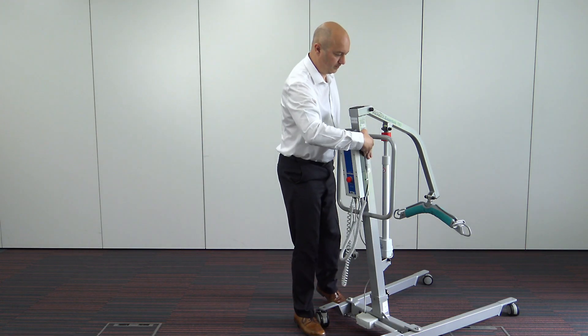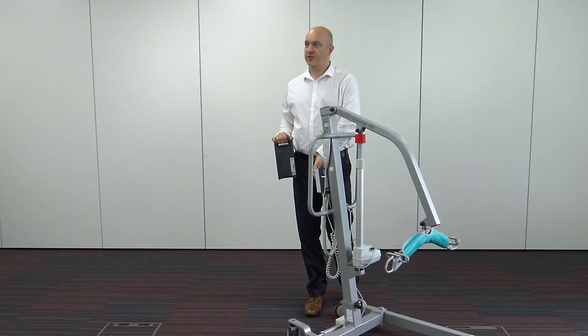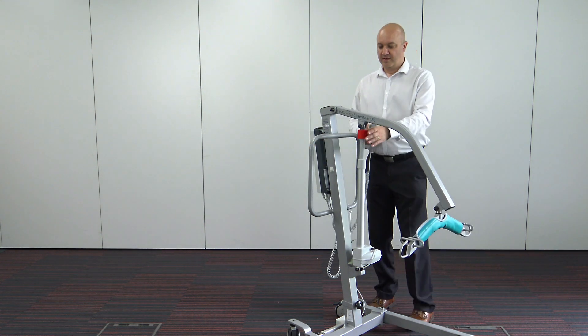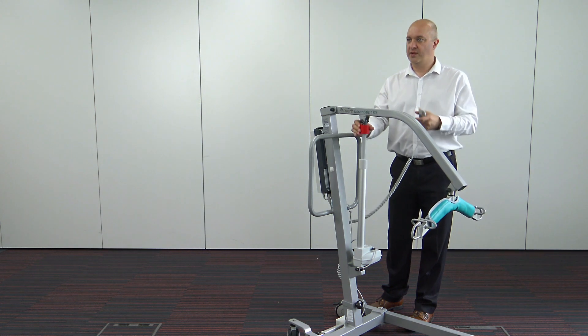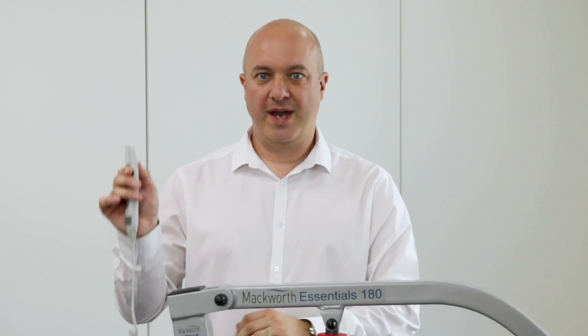The emergency override operates via the battery, so if I remove the battery, that function ceases to work as does the handset. We also have a red toggle — if we turn the disc around, we can actually slowly wind the hoist down manually. Without having to press the down function, we can just wind somebody down in an emergency to get them back into their chair or onto the bed somewhere safe. If we put a new battery on at that point, the power reactivates. There is no reset procedure — you can literally wind it down and then instantly go back to using the handset.